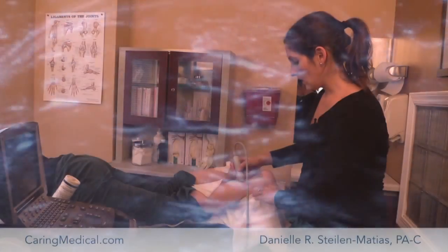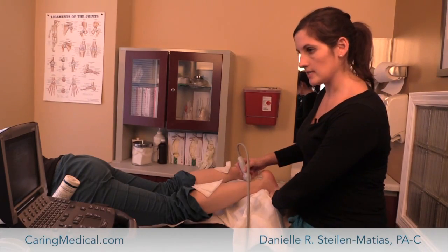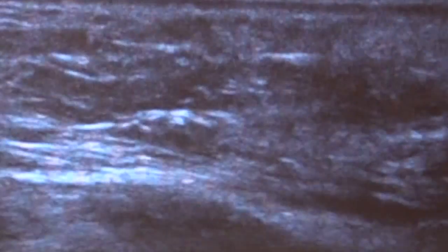And we'll also look at it this way as well — this is just a very quick exam, a quick example — looking for any kind of intersubstance tears or whatnot.